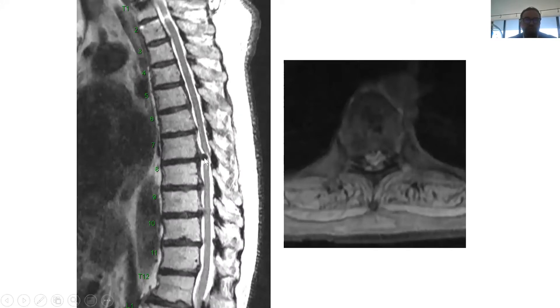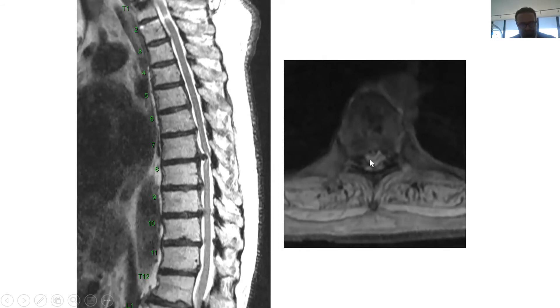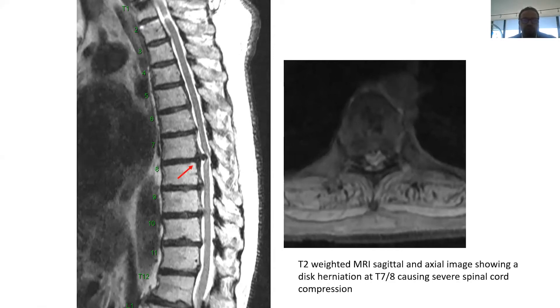You obtain an MRI of the thoracic spine, which shows a big disc herniation here compressing the spinal cord — a lot of pressure on the spinal cord. You can also see edema or swelling within the spinal cord, and definitely this patient needs to be managed surgically.